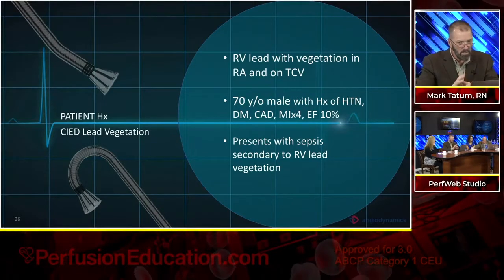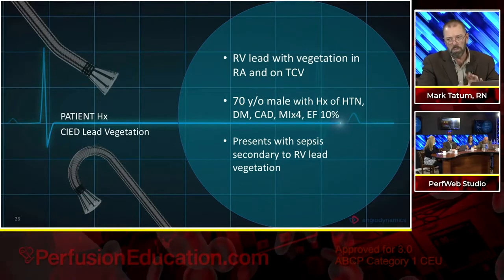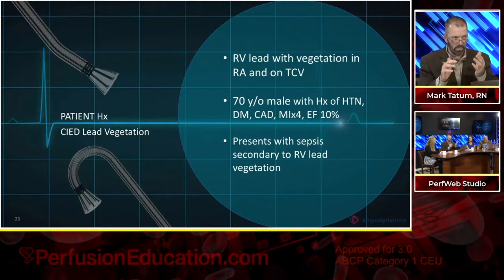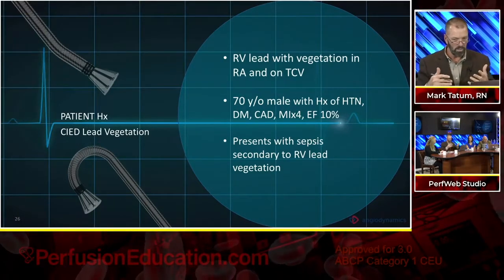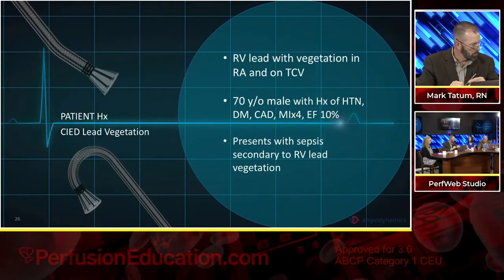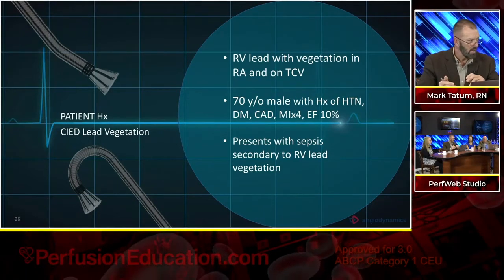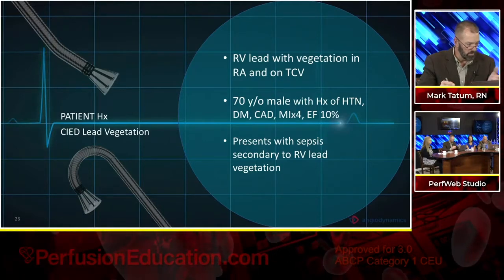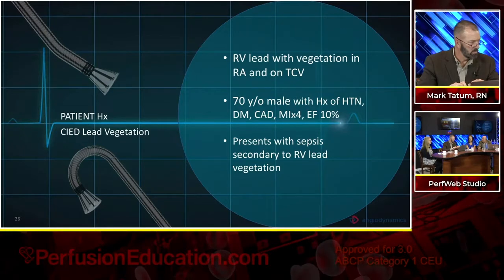But from a hemodynamic standpoint, when you talk about an AngioVac case in general, because we are veno-venous, from the pulmonic valve all the way through, because we're pulling and returning at the same rate, we just don't see change in hemodynamics. Yeah, it's a closed circuit. Closed circuit, closed system, yes. Now, you will have some mild hemodilutional effect, but mild. But you could also do a blood prime and fix that. So there are ways around it.